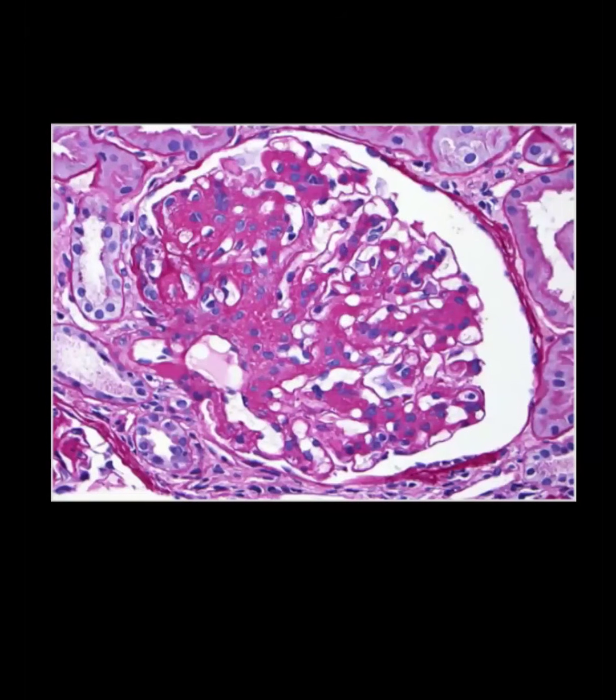So this is again a disease showing mesangial hypercellularity. Which one could it be? You are right, it is IgA.